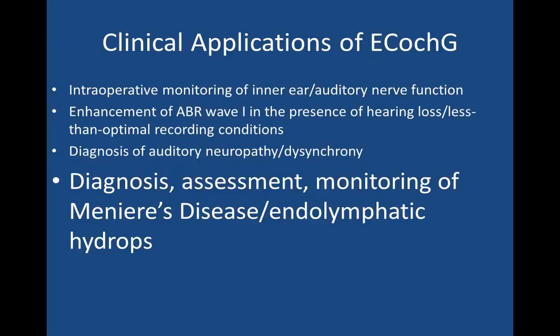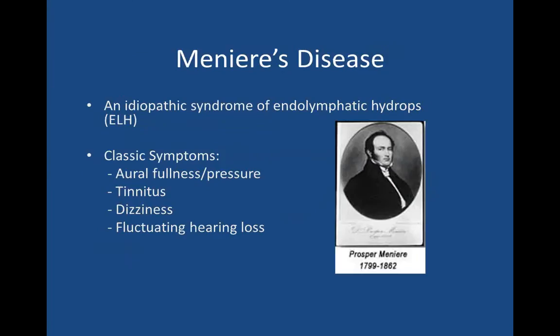if somebody's doing electrocochleography in our clinic, it's mostly to help diagnose, assess, and monitor Meniere's disease or endolymphatic hydrops. This continues to be the primary application for ECoG, and certainly the majority of electrocochleograms that I do are for this purpose.